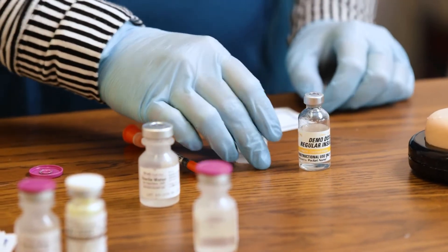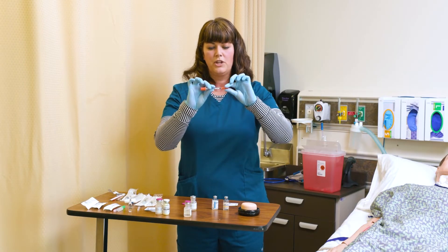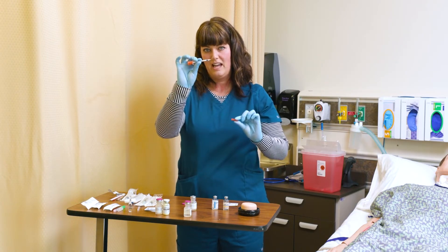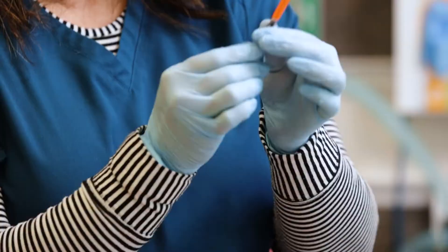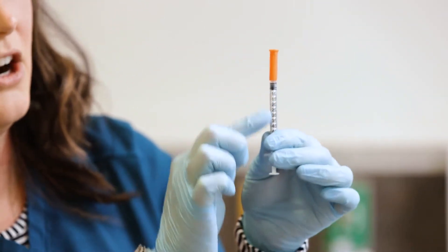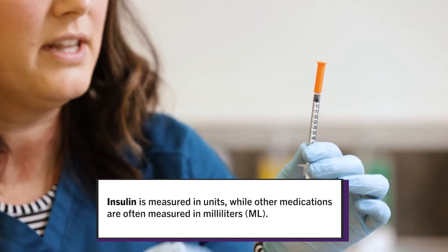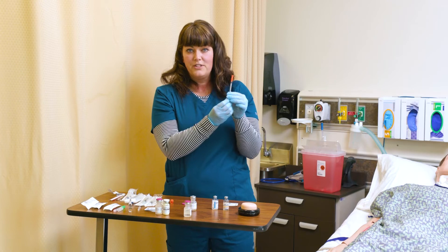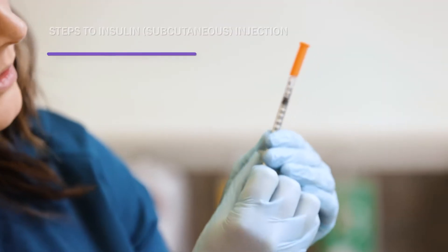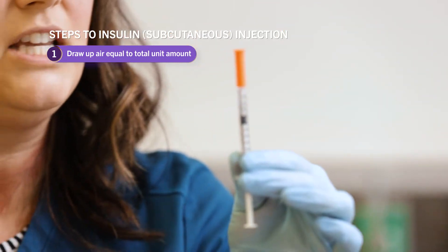I have my clear regular insulin, my NPH cloudy insulin, and my insulin syringe. The needle is already attached. Let's say we're giving 10 units of regular insulin and 10 units of NPH — they can be mixed in the same syringe as long as they're going right into the patient. So first things first, I draw up air. I have drawn up 20 units of air.